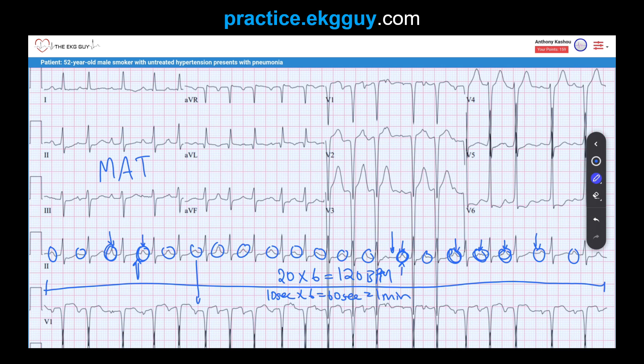An important point: multifocal atrial tachycardia can produce P-wave morphologies that appear as atrial enlargement. For example, a P-wave in lead II may suggest right atrial enlargement, or a finding in V1 may suggest left atrial enlargement. However, the third tip: do not diagnose atrial enlargement or atrial abnormality in the absence of sinus rhythm. Atrial enlargement should only be diagnosed when sinus rhythm is present.